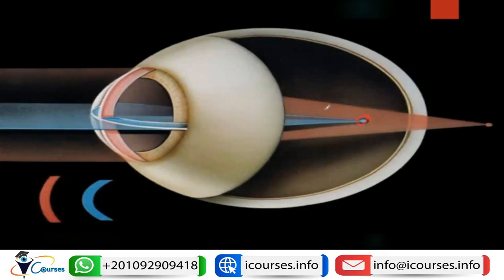will form a focus in front of the retina, while the vertical meridian will form a focus behind the retina. That's why this patient has a mixed astigmatism. So the use of the keratometry is to know how much the horizontal surface and the vertical surface are curved. And by knowing the curvature power of each one of them in diopters, we can know the radius of curvature of each one of them. We can know the astigmatism by calculating the difference between them. And also we can know the orientation of the astigmatism, whether it is vertical, horizontal or oblique.